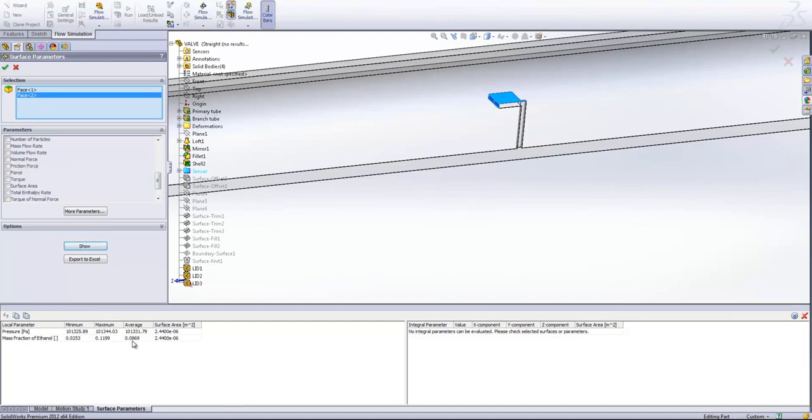But more importantly, we can see that our mass fraction isn't matching up to what it should be. We're looking for that average value to read 0.1, because that's what we want our sensor to read under these flow conditions.